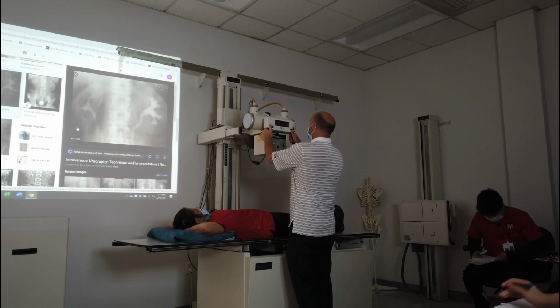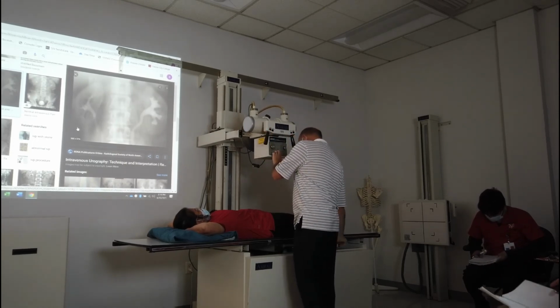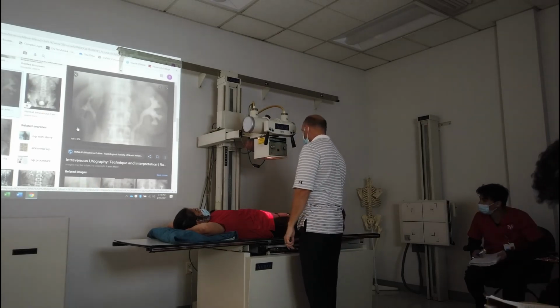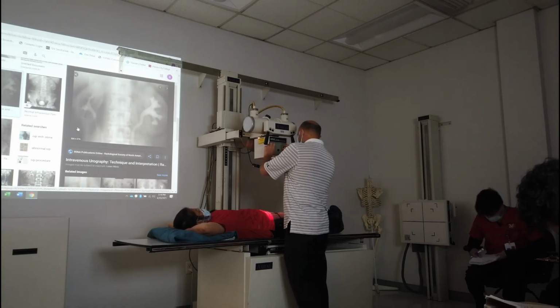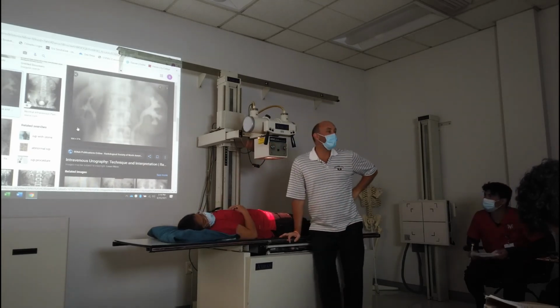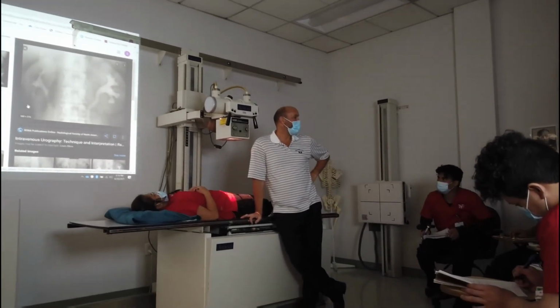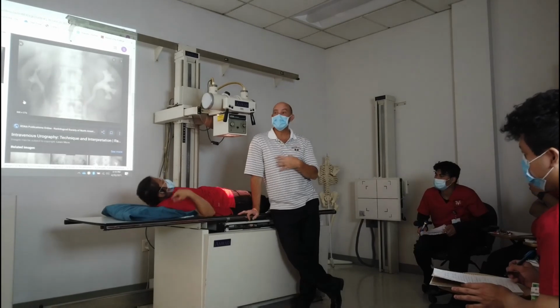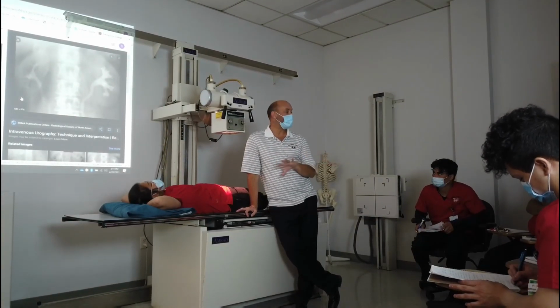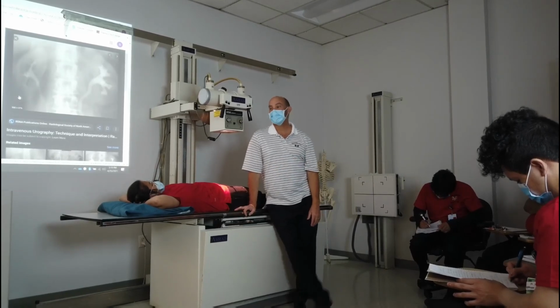Okay. So we're going to start with the kidney shot here. We get our tubes lined up and all that good stuff. If you ever see a nephrogram or it says kidney scout or anything like that, we're just looking at the kidneys themselves. So if that's the case, we're going to use an 11 by 14 and go crosswise. Okay?